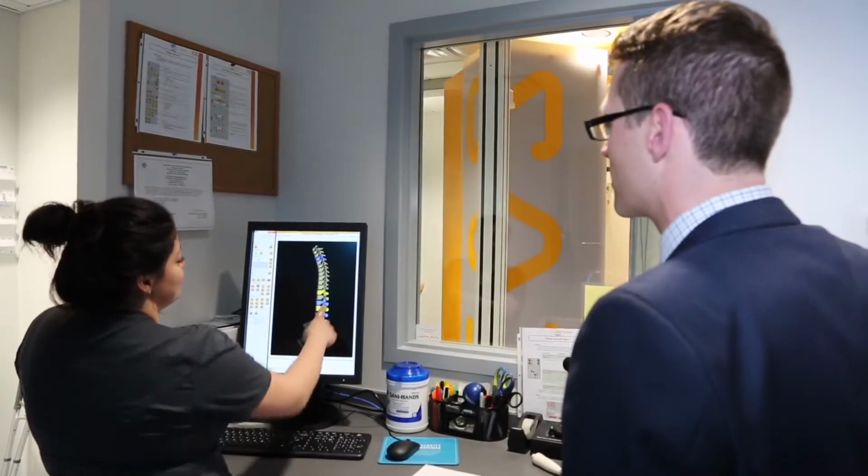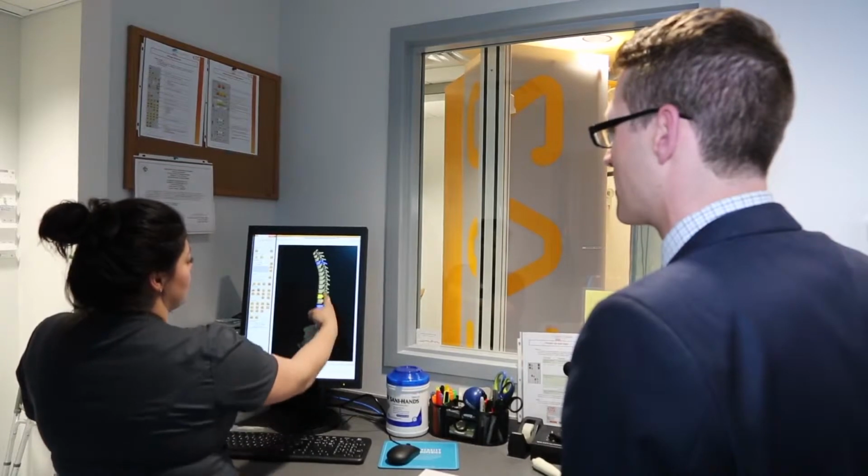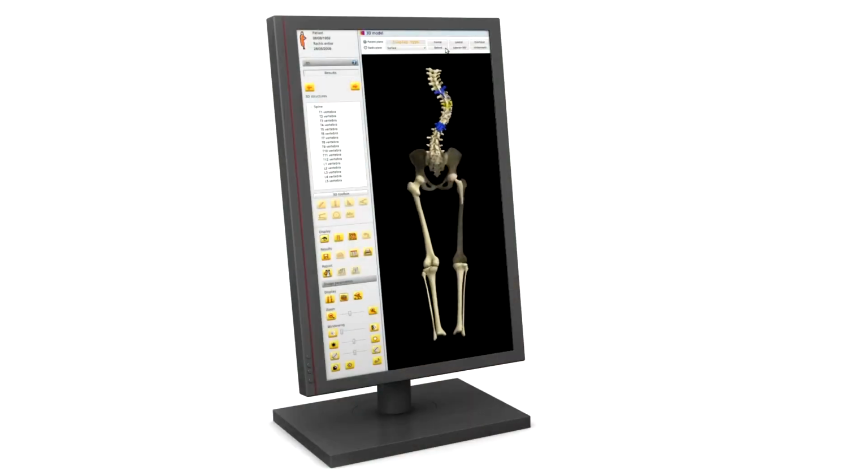So the reimbursement on the EOS is difficult when you try to compare it to a regular x-ray machine. The reality is you can bill multiple CPT codes or multiple studies for each patient that you do. And if you do that, the numbers do work in that the machine pays for itself and its costs. The thing that's difficult to measure is the amount of extra cases that you end up bringing in by being able to offer the service.